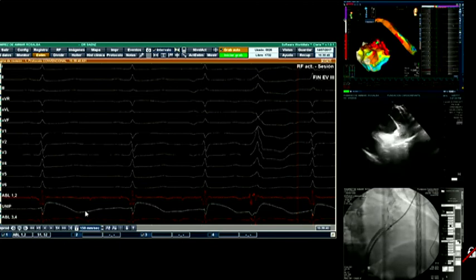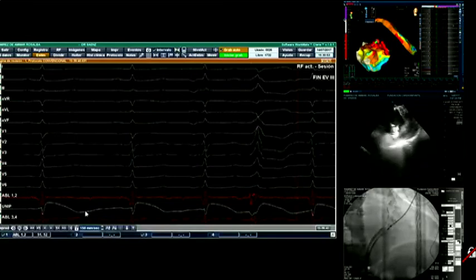I don't think that the previous perforation had much to do with it. There was an anatomical abnormality, and it will always be there whether you come from the neck or from below. But you need to recognize the abnormality of the anatomy to know where to move or not to move the introducers. We weren't doing anything heroic here in order to go in. It's just a normal thing. You place a sheath, you give it the bend, you give it clockwise, and you go into the coronary sinus.